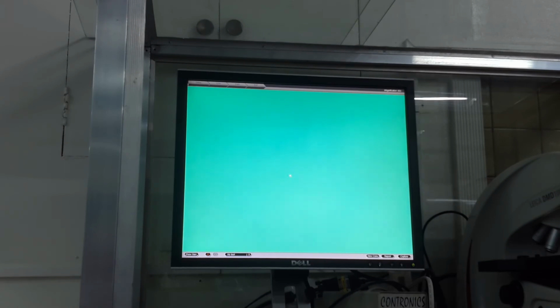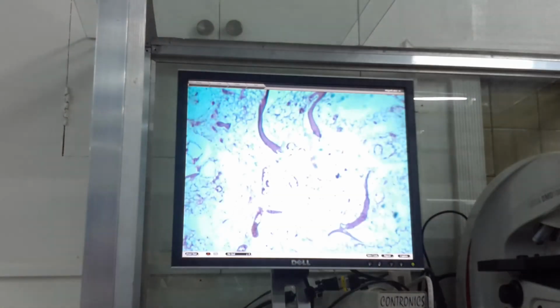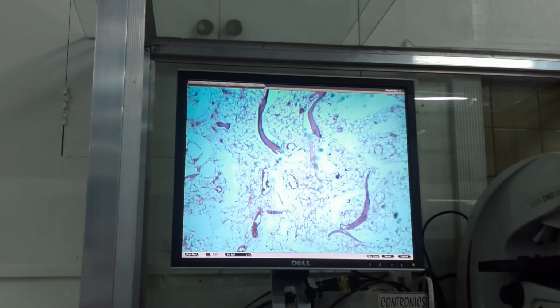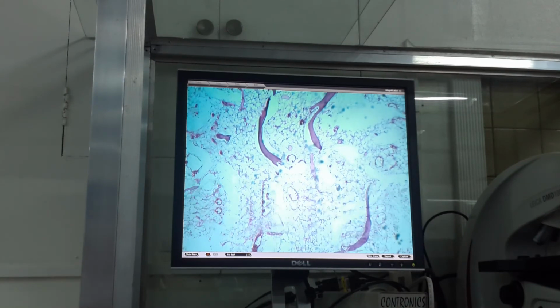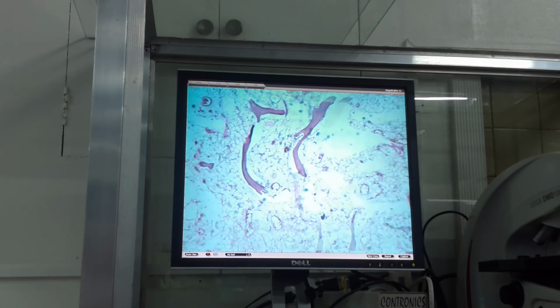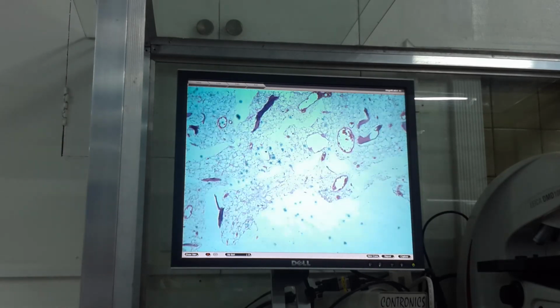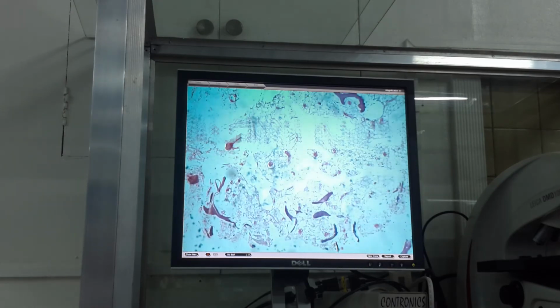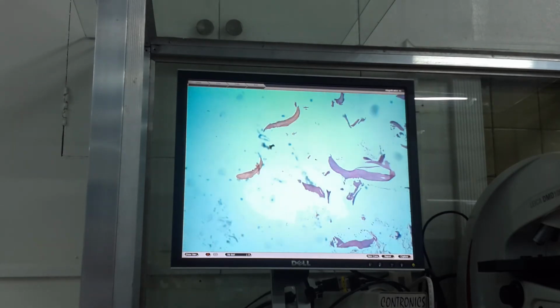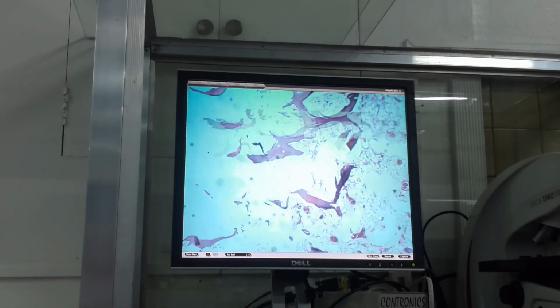And then you have the last slide, slide number 109. Only produced this year. What can you see? May buto at may bone marrow, correct? Hindi pa itong slide natin.